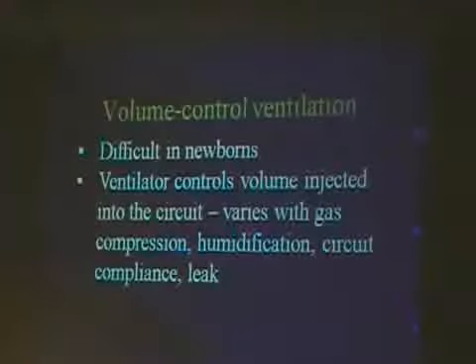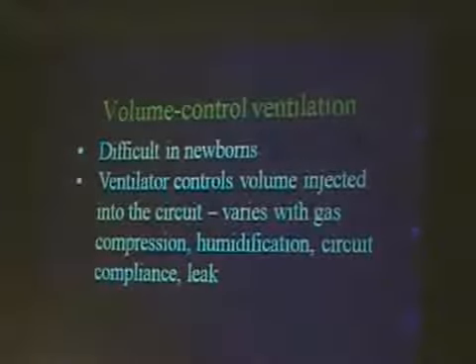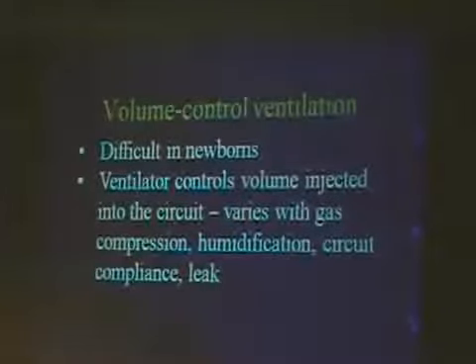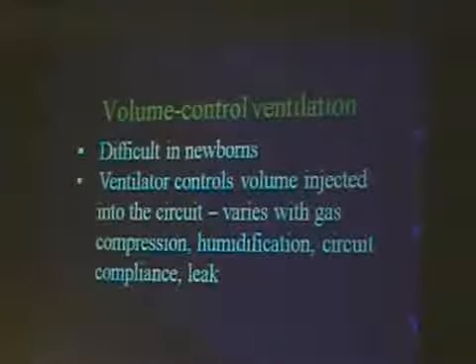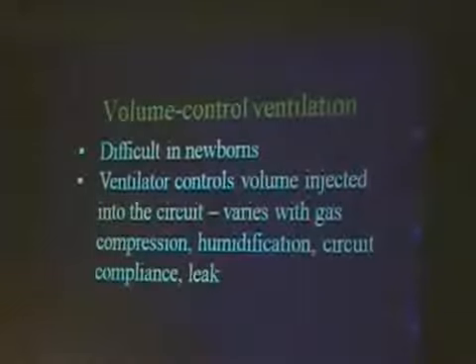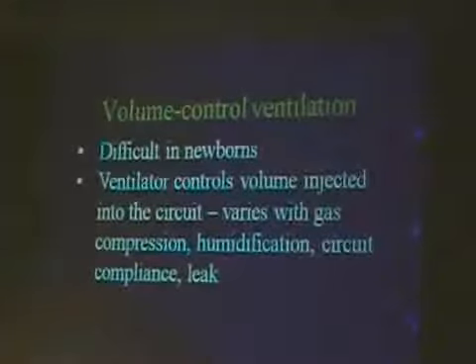Okay, so I want to talk about volume control, because we are going to be going to volume control. You get the talk if you have an addition. Okay. So, excuse me, we're going to be going to volume targeted. Volume control, in other words, where the ventilator is actually told to give a volume rather than a pressure, is very difficult to do in newborns, because as I said, the volume has to be injected into a circuit which varies with gas compression, humidification, circuit compliance, leak, and so on.